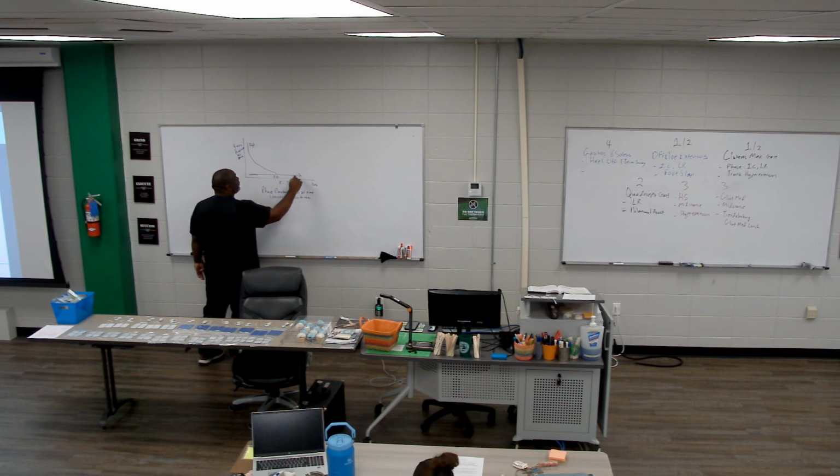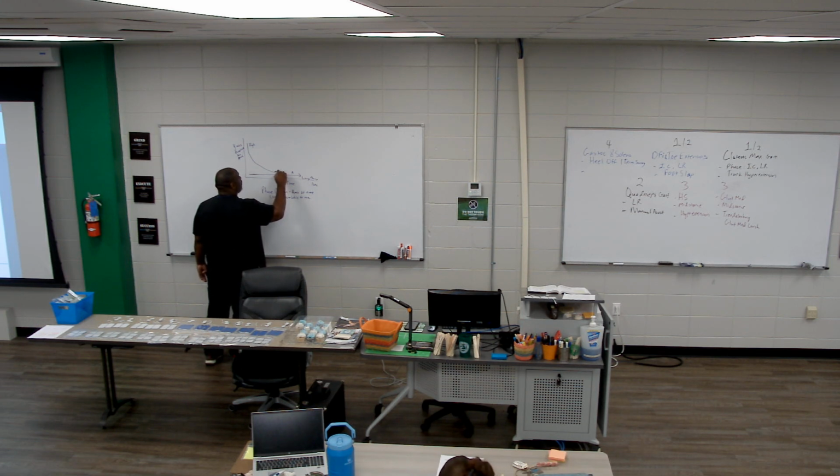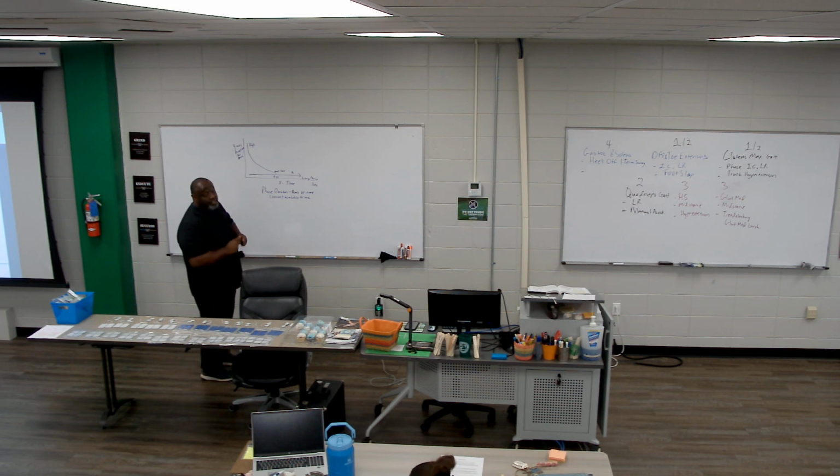But if I have long phase duration, my amplitude is low. So it's inversely proportional.